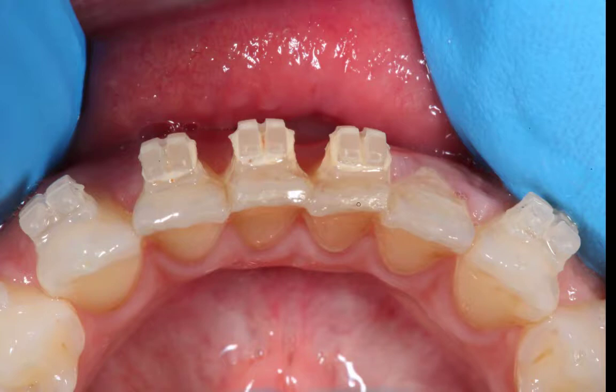The problem is actually bracket positioning. So this is how the patient came in — this bracket just debonded by itself. And you can imagine that if there's a wire going through all of these brackets, the wire is going to be pretty much flat, which means that there's very little force actually going onto the tooth. But can you see the incisal edge of this tooth is like that, whereas this bracket positioning, especially when you look at it closely, is like that — and they're not parallel with each other.